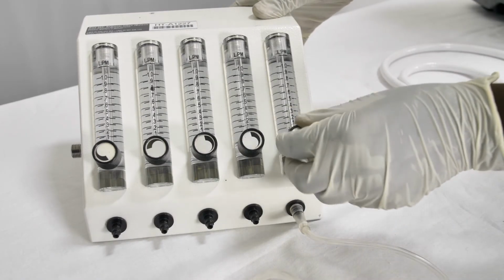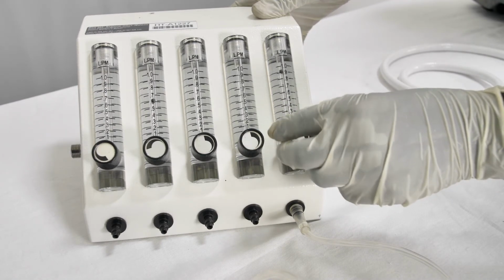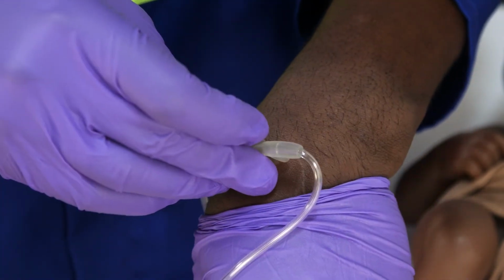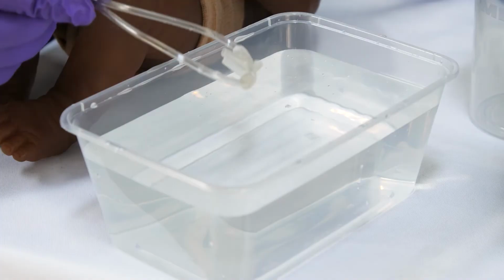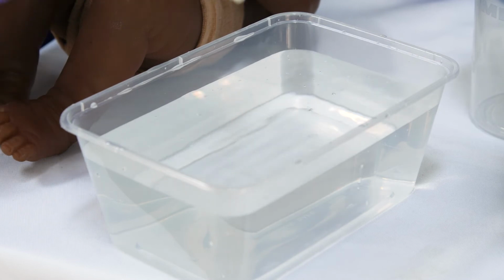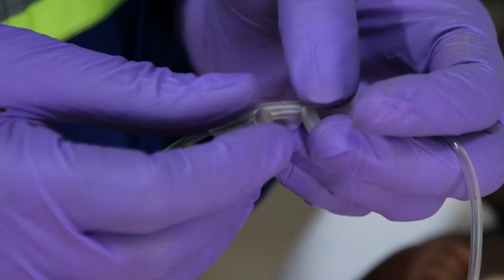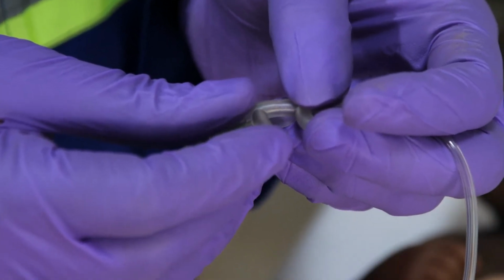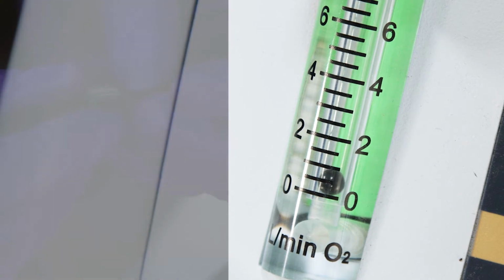Next, set the flow rate to the level prescribed for the baby. Now, check that the oxygen is flowing. You can do that by feeling on the back of your hand. Or you can put the prongs into a beaker of clean water to see if it bubbles. Finally, you can also pinch the prongs, in which case you will have stopped the flow, so you should see the flow meter fall to 0. It will go up again when you let go.